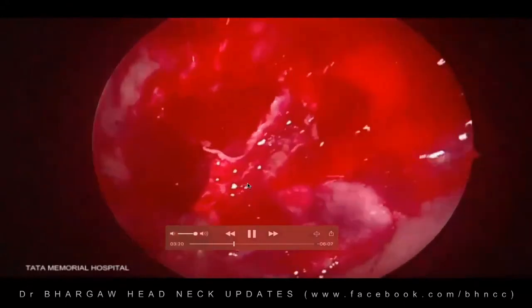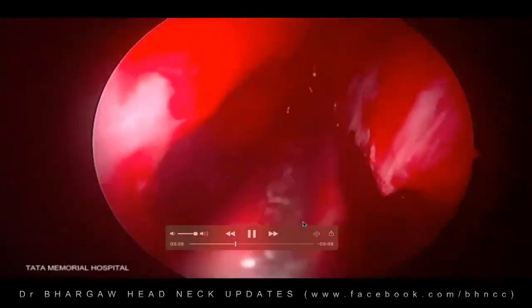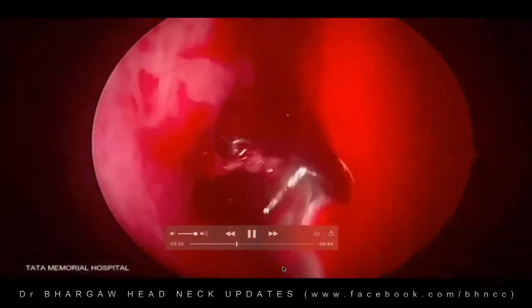This is the Hadad flap here, and this is the choana here, as you can see on either side. And this is the anterior part of the nasal septum. We just removed it for better clearance. So we debulked the tumor as much as we could.